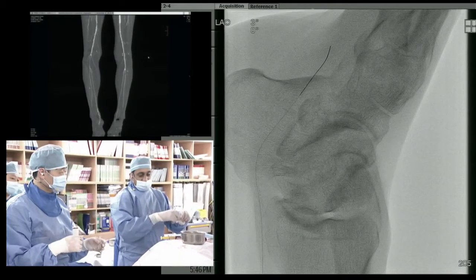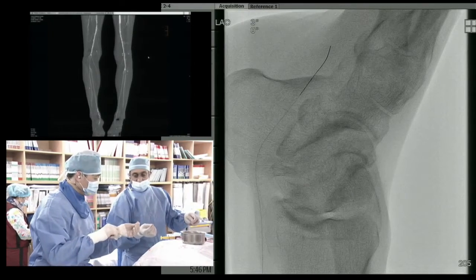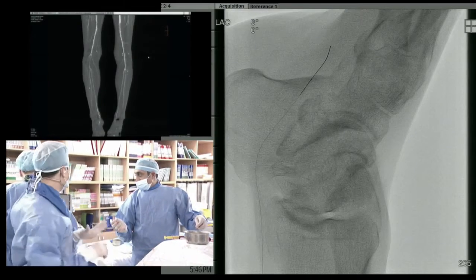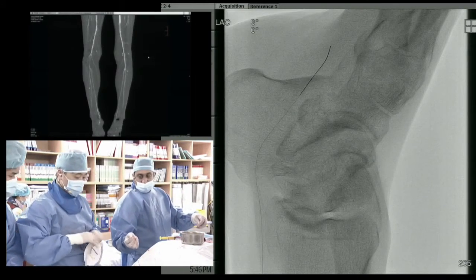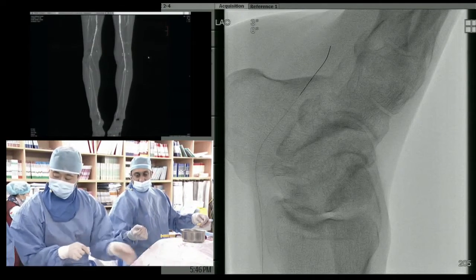So I need to balloon that total occlusion, but we had a short wire, so I had to switch out for a long wire. We're going in with the 2.0 balloon, 2.0 by 100, that's fine. We're going to balloon that segment, create enough space for the embolic protection device, and then move forward. Would anybody just go ahead and treat that with a DCB or stent it?